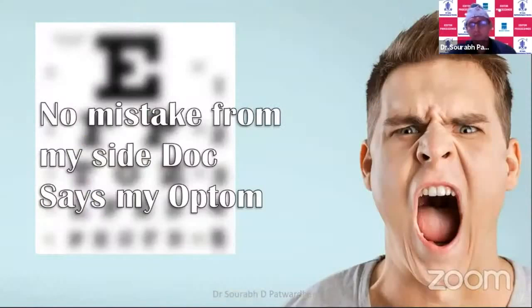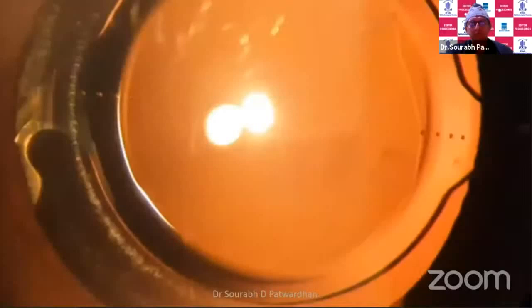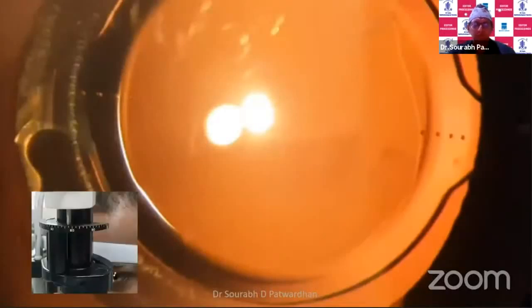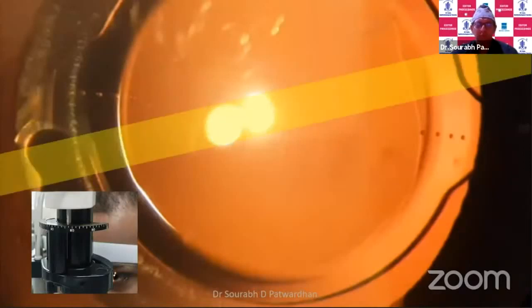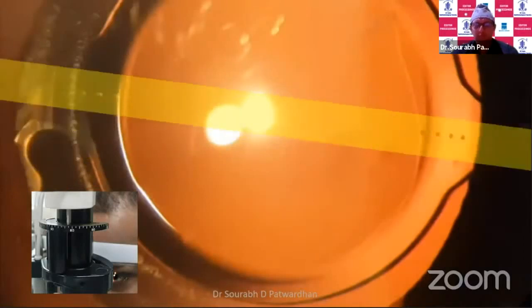Now by this time our optometrist is quite angry with us, because there was no mistake from his side in this case. Everything was perfect. So what was the problem? We have to check the IOL position, where we may have done something wrong. To check that on slit lamp, you just have to use a thin slit beam, and then you can rotate this beam and align it, with a dilated pupil, along the toric IOL marks, and check the actual position of the IOL in degrees.